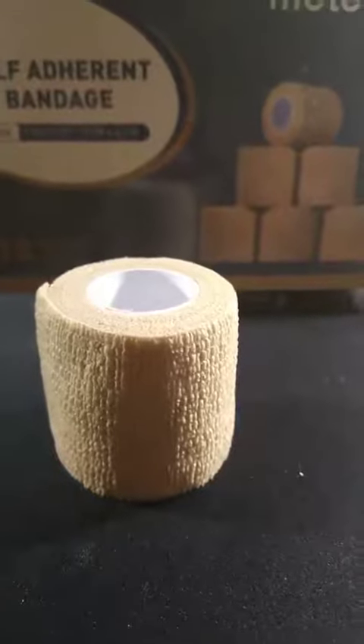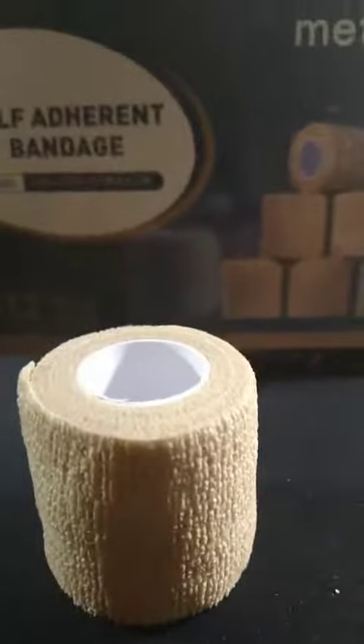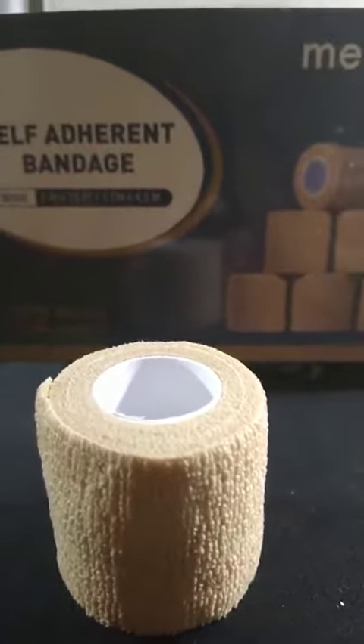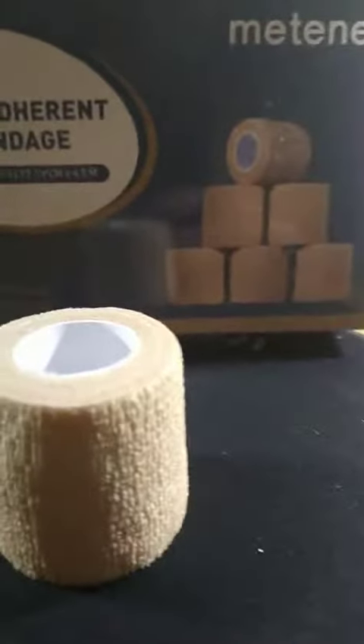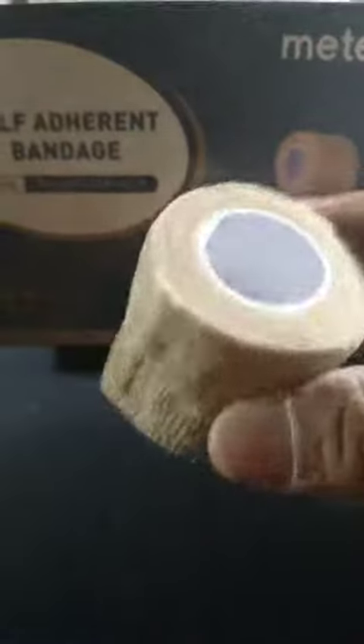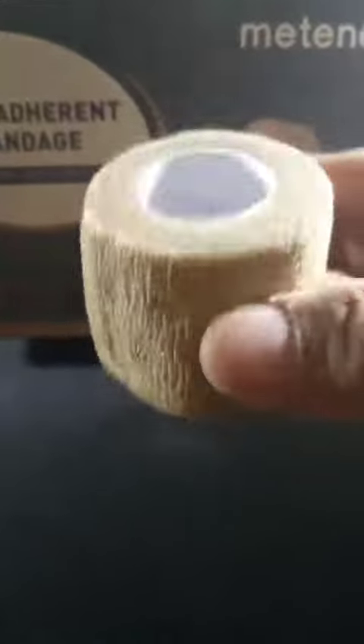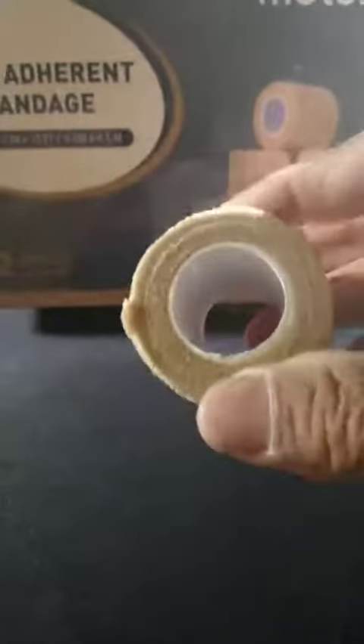Hey guys, I'm reviewing this 12-pack self-adhesive bandages. These are amazing. You get 12 of these for about 10 bucks, so these are less than a dollar each. You can get these from a dollar store but they're not as good and they're also a lot less.